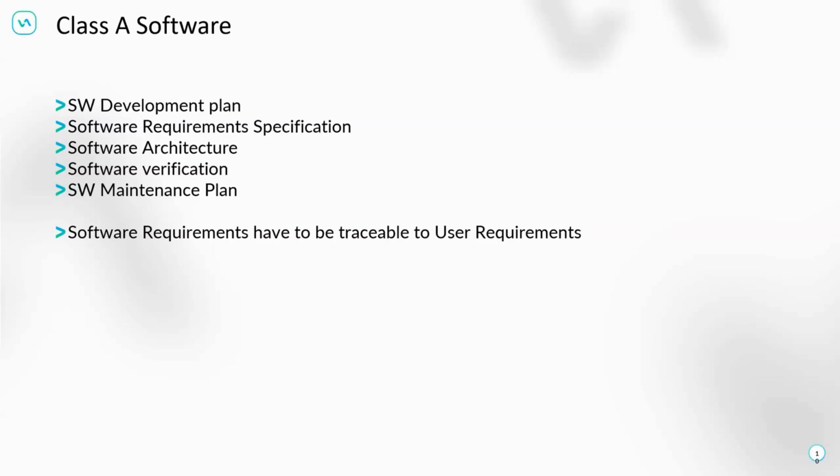So, since you have requirements, you will need to have software verification. And as said, you always have the unit verification, if needed, for Class C software. Then you have the integration verification, and you have the system verification. For the software requirements itself, the software system verification is the relevant one. So in a software verification you verify that these particular points are included.